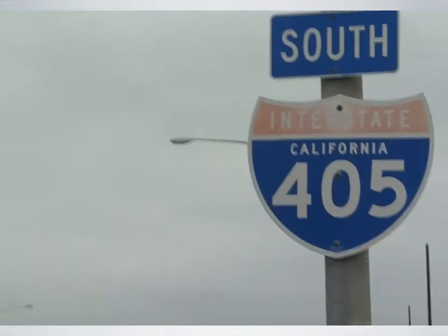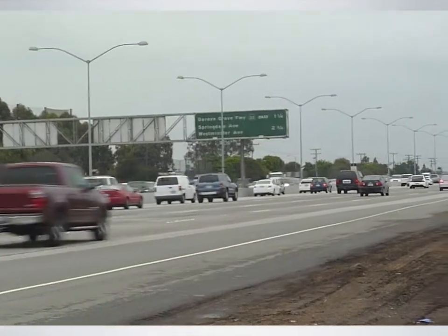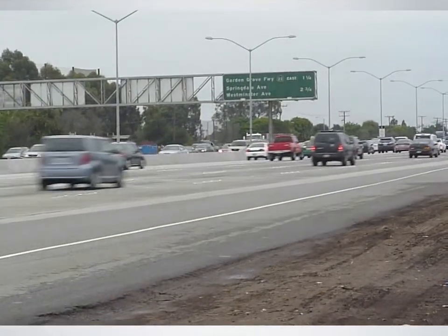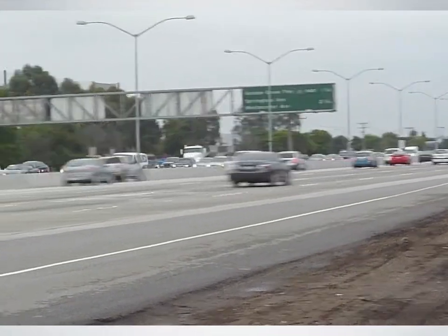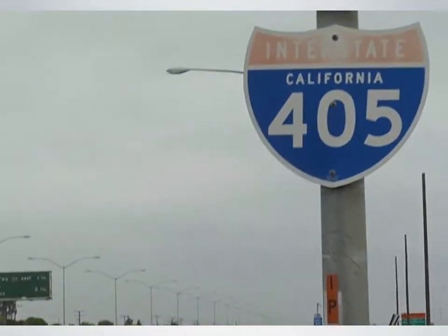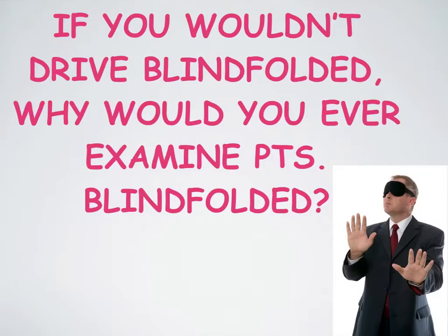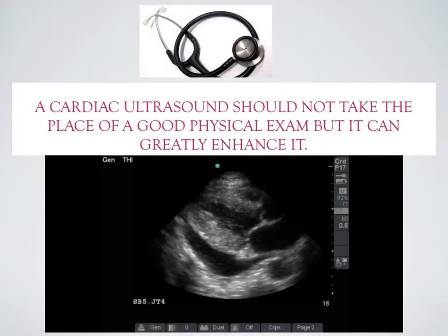Welcome to the 405 freeway, Southern California, and I think we could agree on two things about this freeway. It's one of the busiest places, so there's a zillion cars, but nobody is driving blind. So if you don't drive blind on the freeway, why would you ever examine patients blindfolded? And to me, that's kind of what it's like using a stethoscope.